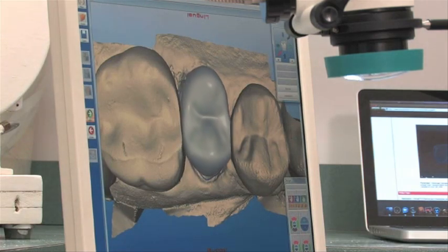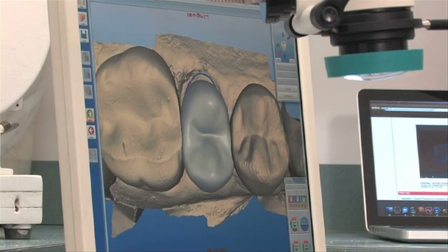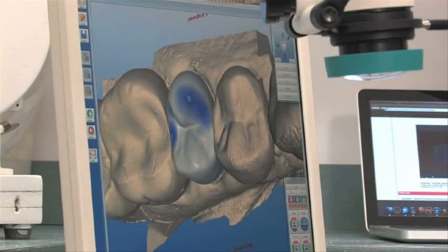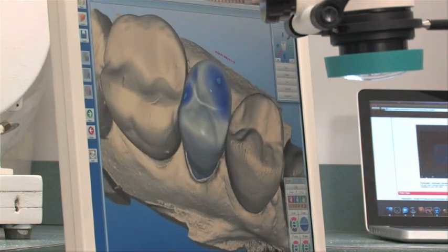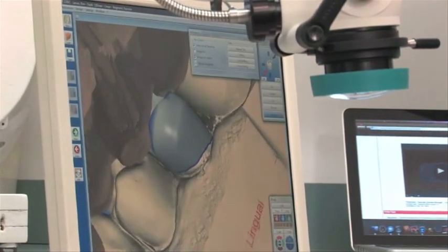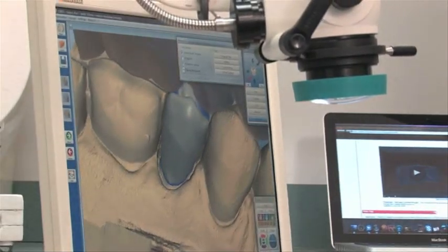The computer has what they call biogeneric software, which takes into account not only the preparation that was done and the bite of the opposing tooth, but also the shape and character of the adjacent teeth, and it will design a restoration that is in harmony. The computer has already given us our first pass at the crown it proposes. The blue marks are where the bite contacts will be. If we turn the opposing model on, we can start taking advantage of looking at it, going around to the other side to see exactly where the bite is going to touch and decide how to modify this crown to be as optimal for this patient as possible.